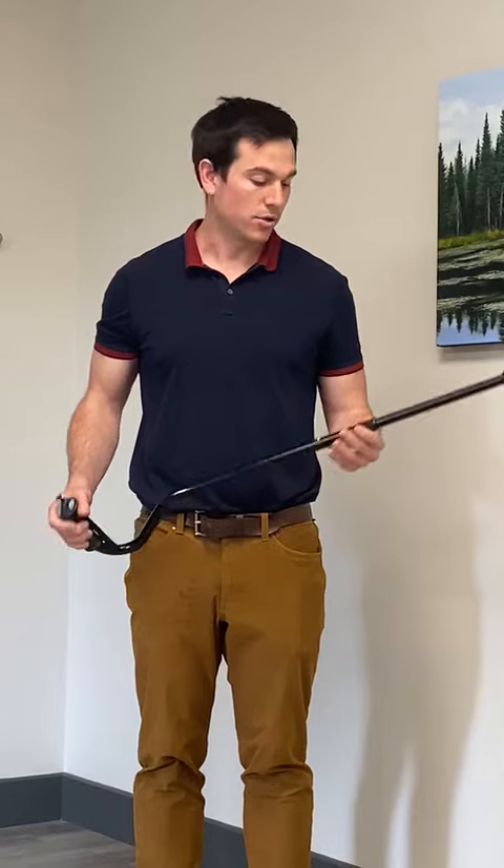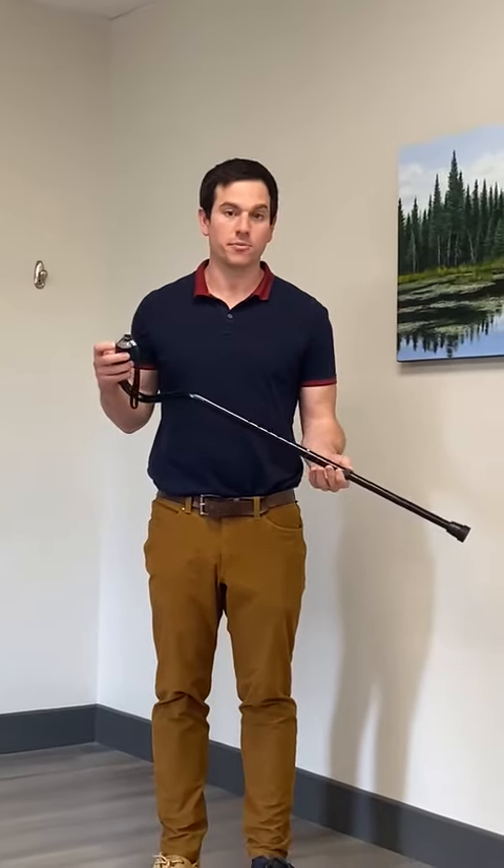Hi, my name is Colin. I'm a physiotherapist at Orthopedic Rehabilitation Institute, Kawarthas in Peterborough, Ontario. We're going to talk a little bit about how to use a cane today. This is a typical adjustable cane that can be bought fairly inexpensively at many retailers.